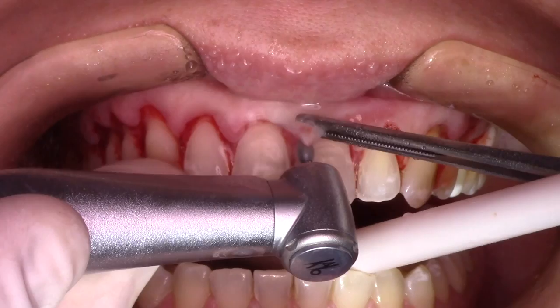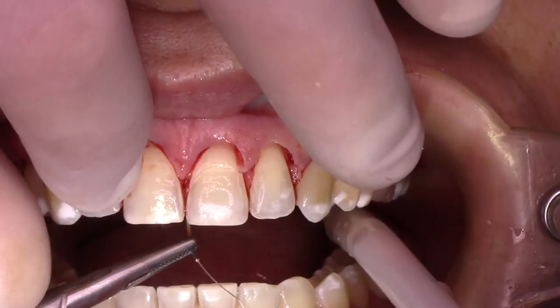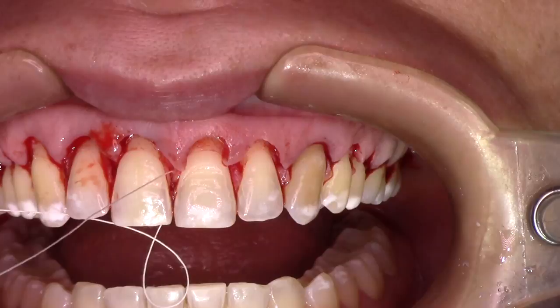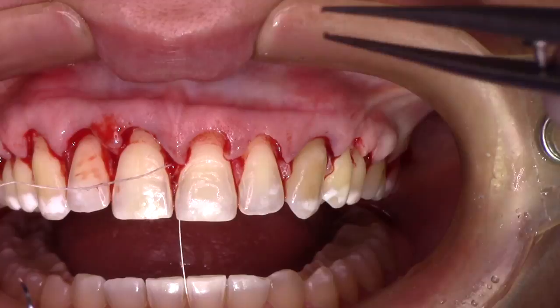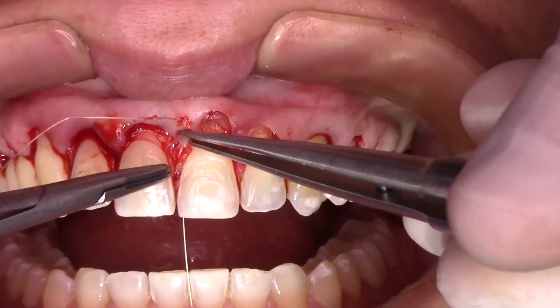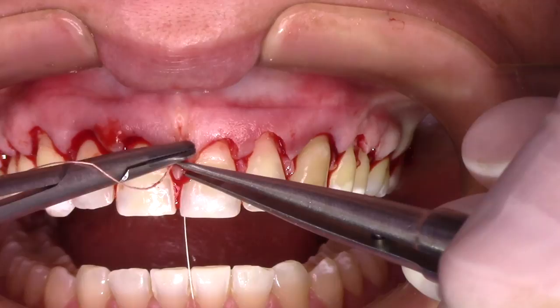For the sutures, we like to place the knot on the palatal side: first, because we have a more aesthetic outcome, and second, because I want a clear view of the buccal side when I'm doing the refinement of the bone and tissue contour with the lateral scalpel — so I don't have the knot blocking access to the tissue contouring, as you can see a little further in this video.